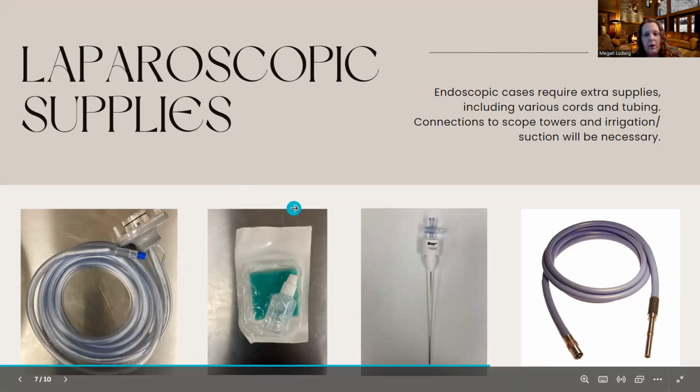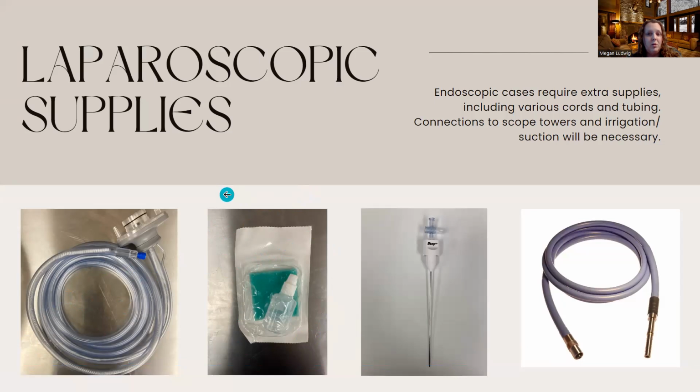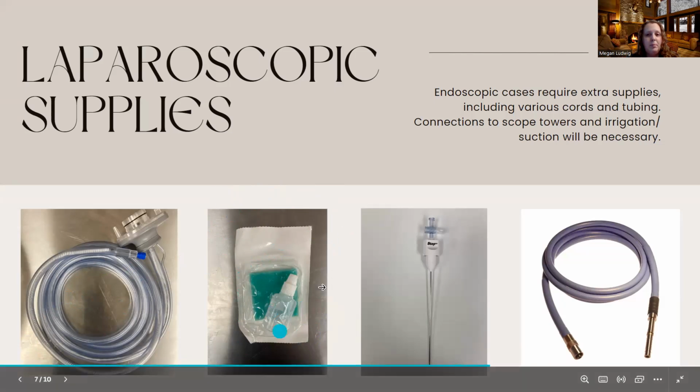This is what we call FRED, or anti-fog solution, whatever you want to call it. FRED actually is an acronym, F-R-E-D: Fog Reduction Elimination Device. I think that's been a certification question before, so keep note of that. Now, if you're scrubbing in, this is a countable item.